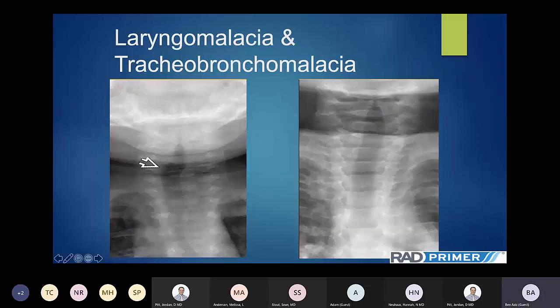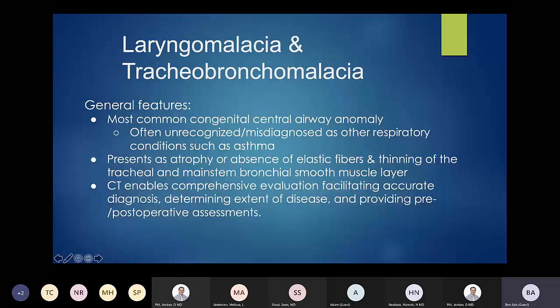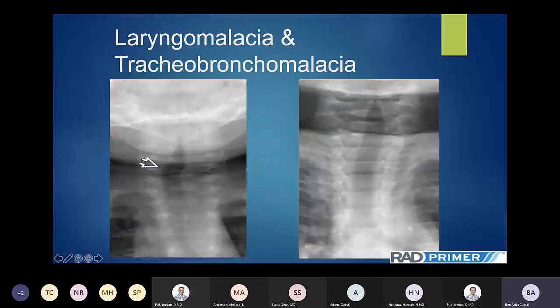Moving on to laryngomalacia and tracheobronchomalacia. On these frontal views, you can see significant narrowing of the larynx with a little dilation of the trachea in one, and in another, narrowing of both the larynx and the trachea. The malacias are the most common congenital central airway abnormalities. They typically involve atrophy of the smooth muscle layer within the trachea or mainstem bronchi, causing thinning — and when that smooth muscle layer thins, it can't keep the airway open, so it collapses on itself. This presents as an increased tracheal diameter with a tendency to collapse on expiration.